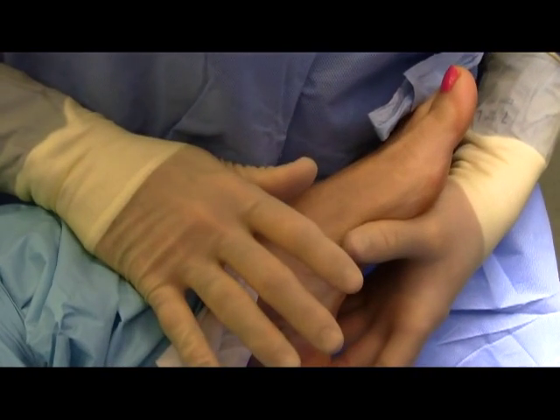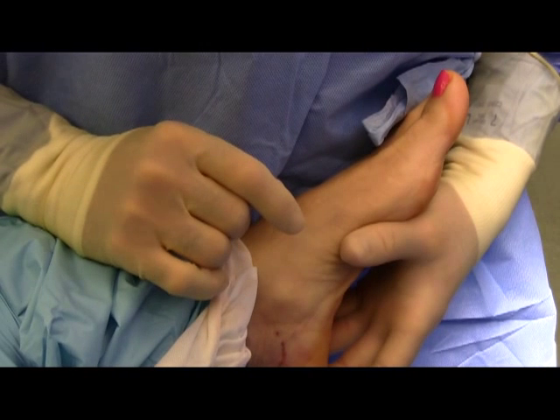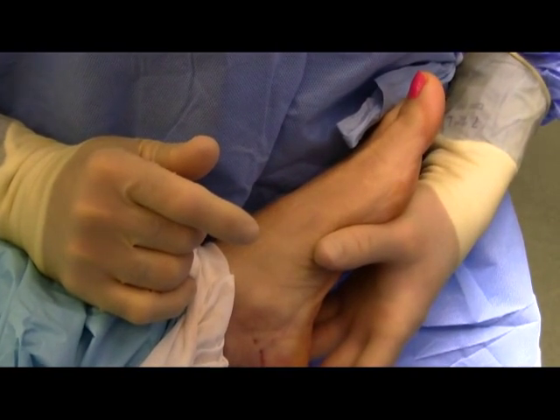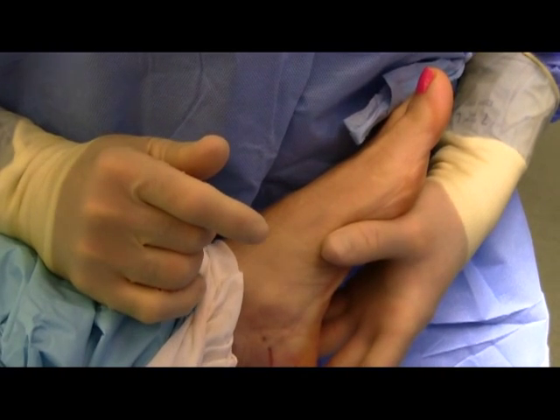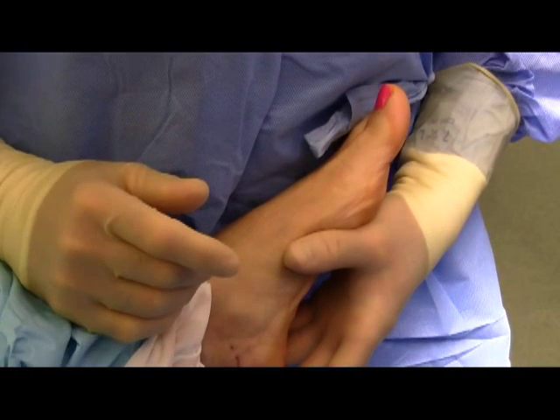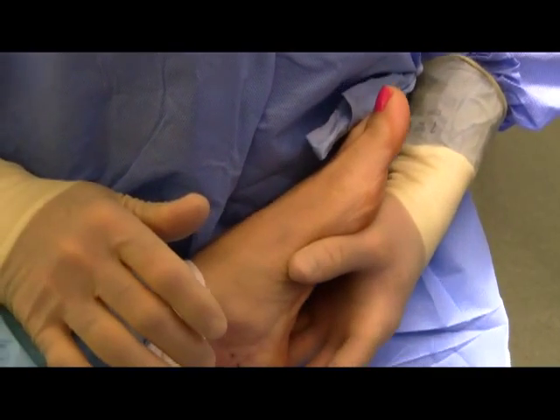This patient has chronic plantar fasciitis. We're going to do an endoscopic plantar fasciotomy and then inject the area with autologous conditioned plasma, very similar to PRP, platelet-rich plasma. The procedure is done to alleviate heel pain.